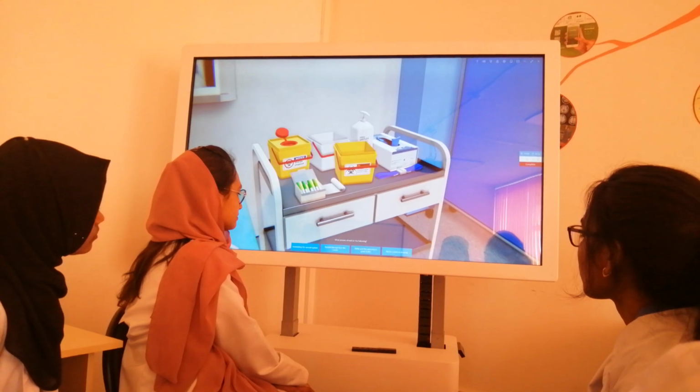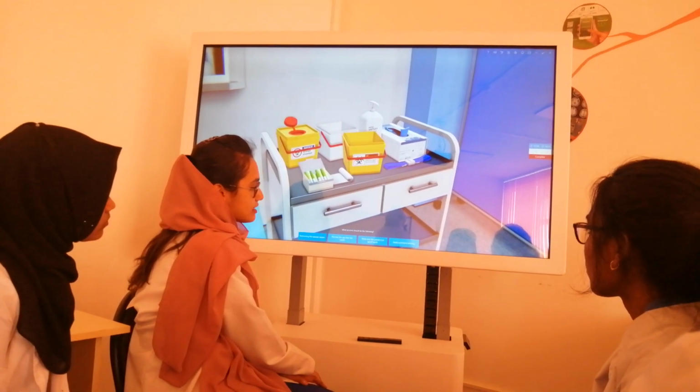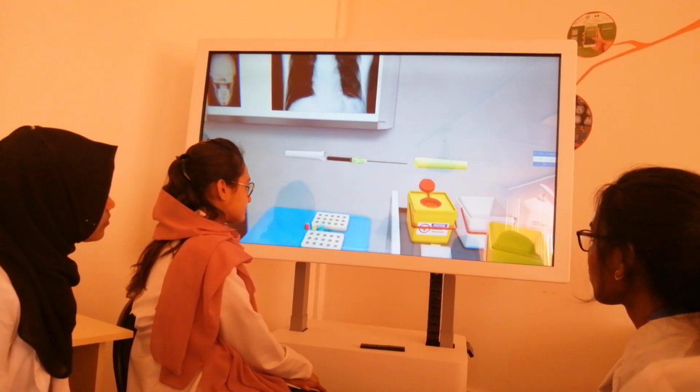What process should be the following? Assembling the vacuum system. Remove the cap from the needle. Make sure the patient is in good health. Apply a pressure dressing. Assembling the vacuum system. Assemble the vacuum system. Screw the needle into the needle holder.